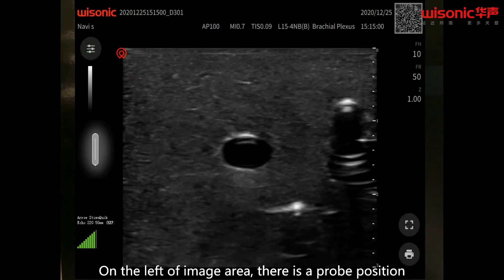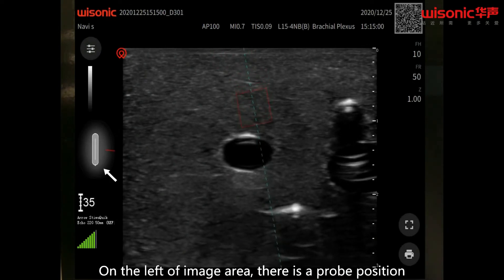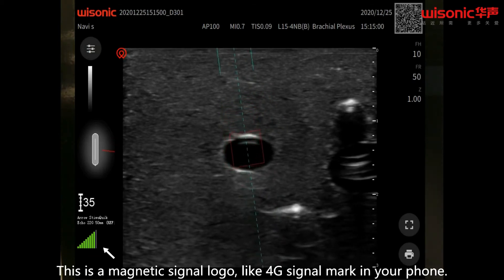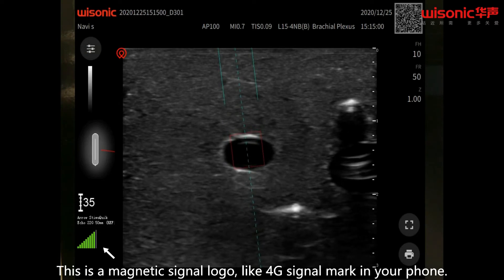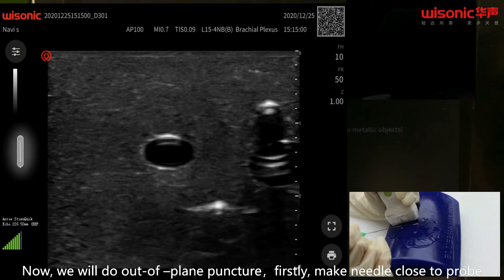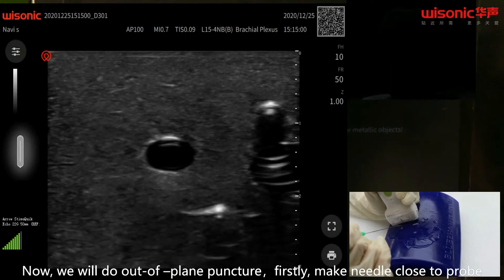Users can start to puncture. On the left of the image area, there is a probe position indicator. You will see a red line, which demonstrates the position of the needle. This is a magnetic signal logo, like the 4G signal mark in your phone.